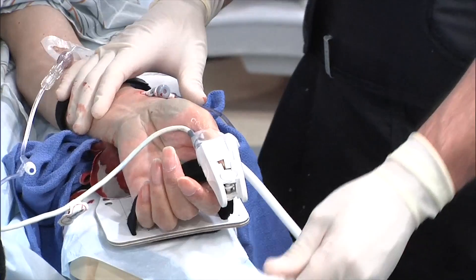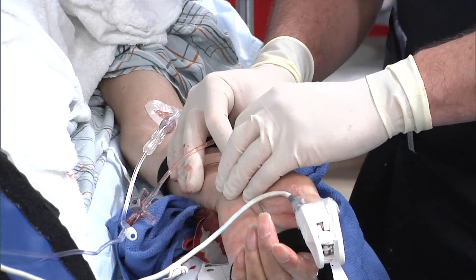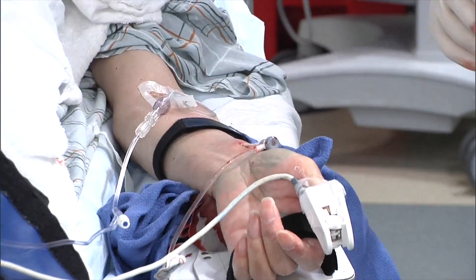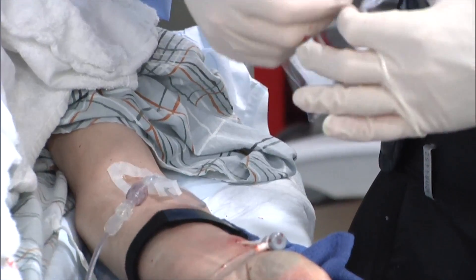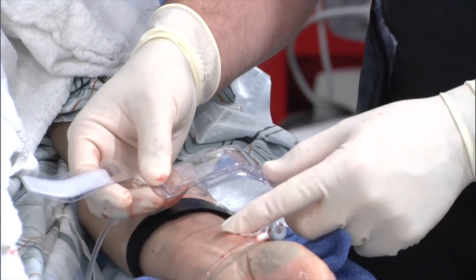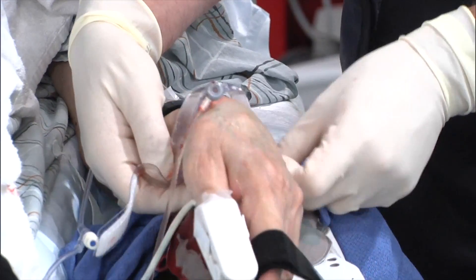The way that we close the artery is really pretty simple. This is a five French Merit Prelude sheath. What I usually do is I pull it back about an inch outside the skin. It's clean and dry. And then I position this band — this is the TR band from Terumo. You can actually see the green dot here. The green dot needs to be not over the skin puncture site, but over the entry into the vessel, which is a bit higher. So I'm going to wrap that right here and try to position it exactly.